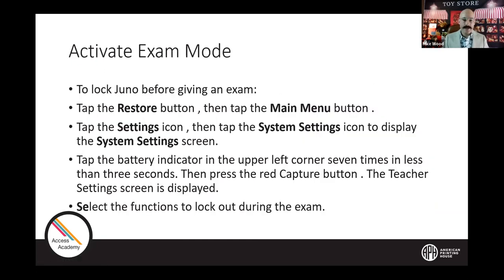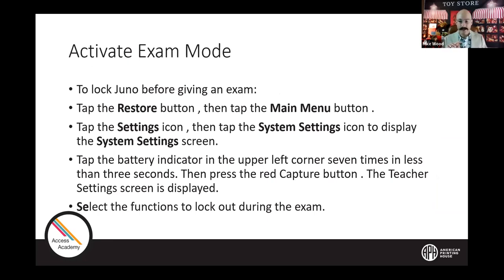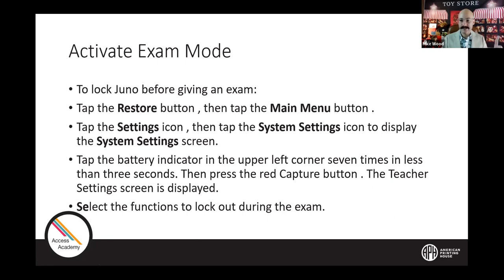If you wanted to allow a student to use the Juno as a magnifier during an exam but cut out some other functionality, you can do so with exam mode. To lock the Juno before giving an exam: tap the restore button — the button on the bottom left-hand side with two arrows pointing to the right. Then tap the main menu button — top left-hand side, the three lines. Then tap on the settings icon, then the system settings icon to display the system settings screen.